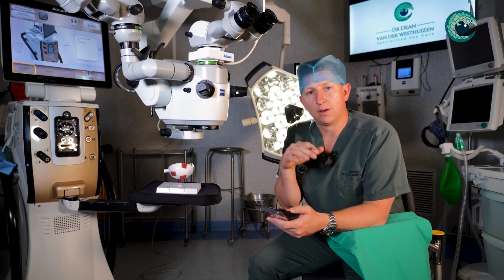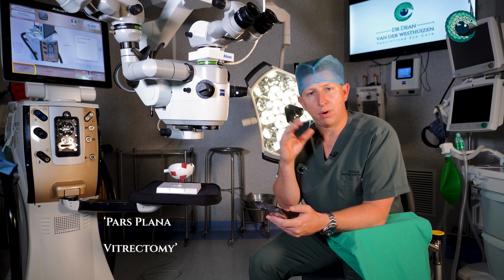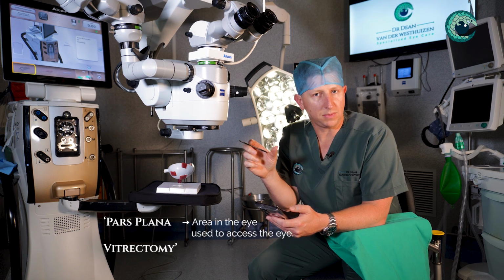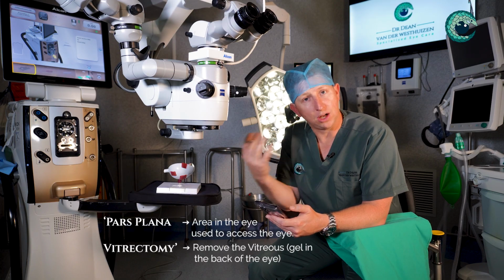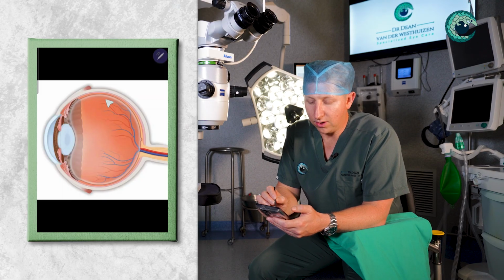Okay, so the first thing to understand when we talk about pars plana vitrectomy: pars plana is an area in the eye that we use to access the eye, and vitrectomy means to remove the vitreous. So to access the back of the eye, you need to remove the vitreous. Vitreous is the gel in the back of the eye. If you look at this diagram here, this is the gel at the back of the eye that gets removed.